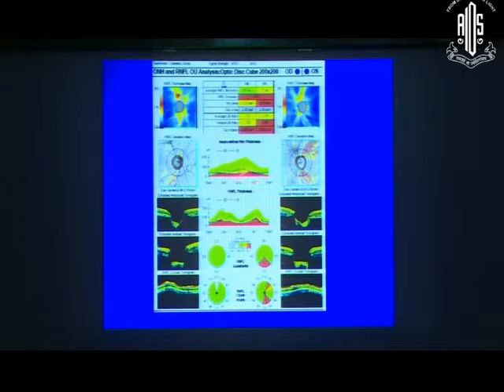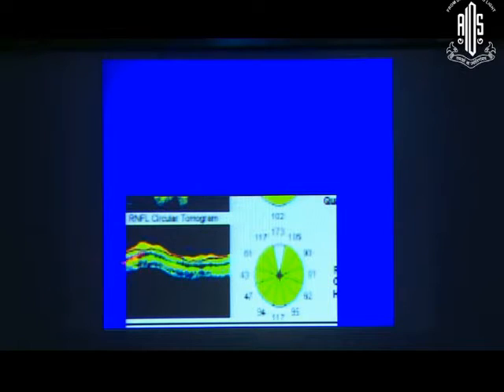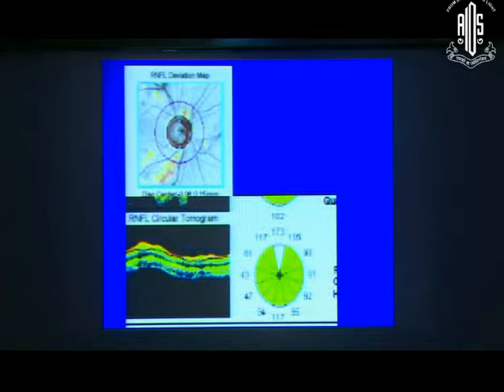Okay, this is one more. So if you look at this here, I want you to pay attention to this bit. Now when it's outside the green zone, it basically means that that is supranormal. And that supranormal bit looks like it's at 12 o'clock. So let's take a closer look at this image here. And what you're seeing is this bulge here, which is contributing to the supranormal bit on the OCT printout. And if you try and correlate this with this, what you're seeing are those two blood vessels. So it's possibly taking those two blood vessels. You're seeing some shadowing here, which is probably those two blood vessels. And that's the reason it's looking higher than normal. So if you have a nerve fiber layer defect which is very close to those blood vessels, you'll actually miss it. So you must look for these segmentation artifacts whenever you see something which is out of normal.